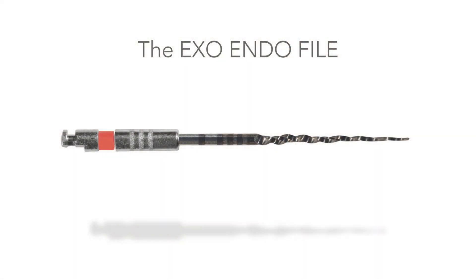The exoendo file is our second rendition of this patented design and represents another exciting advancement for endodontic files. Introducing the exoendo file.